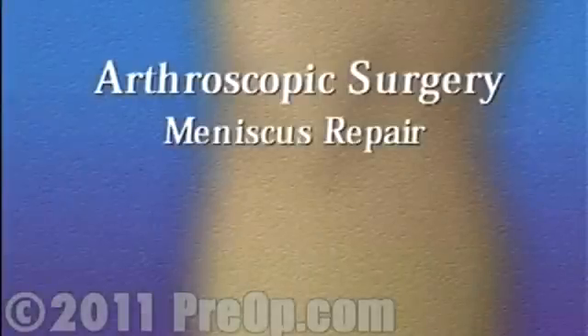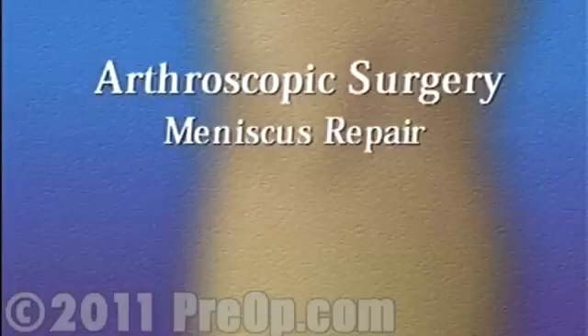The doctor has recommended that you have arthroscopic surgery in order to repair a torn meniscus in your knee. But what does that actually mean?